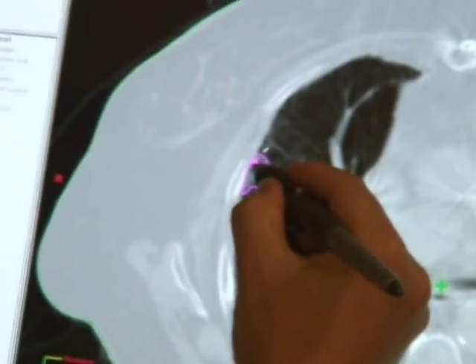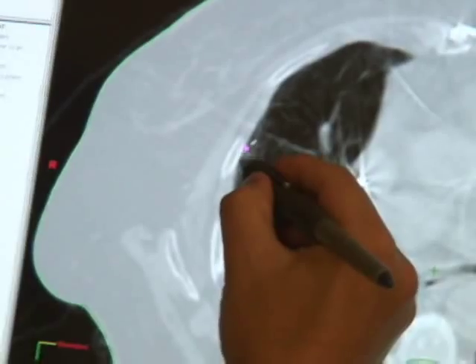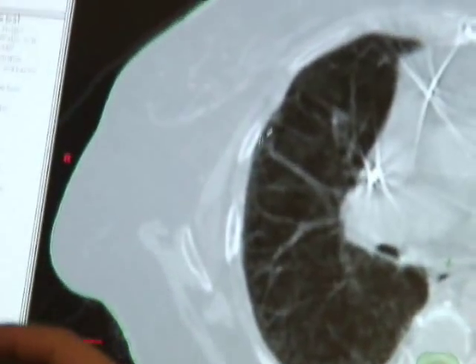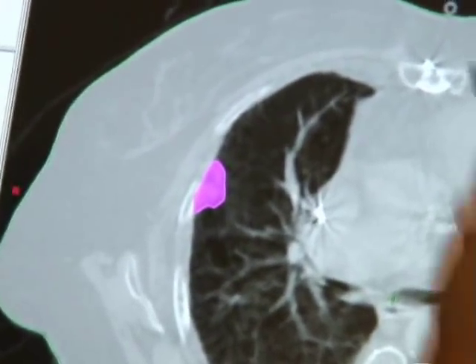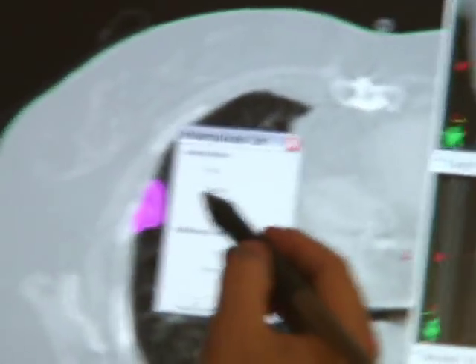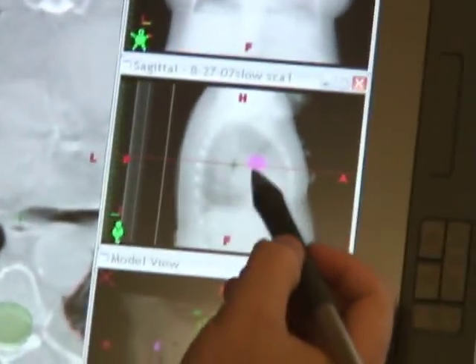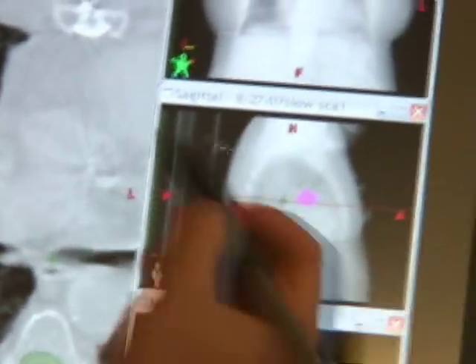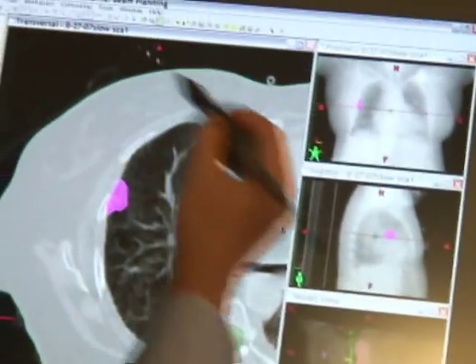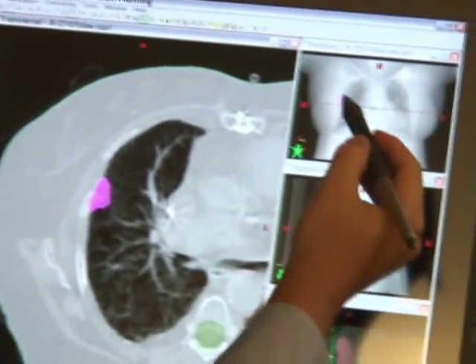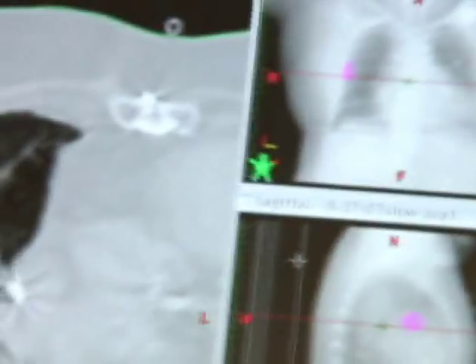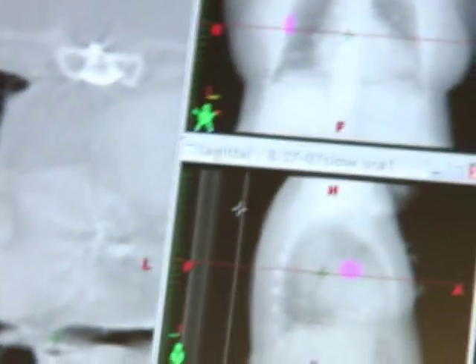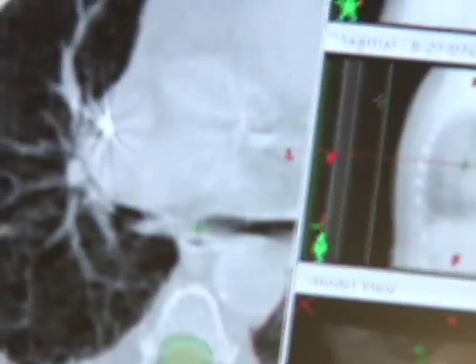This is a slow, very slow CT scan simulation. You can see here in this view how I've not contoured every slice, but when I go up here and do interpolation, we now fill all of that. This is sort of typical of the slow CT scans — you see an elongated appearance to the tumor, and that is overestimating the actual tumor size, but it gives you the correct ITV so that you can cover the tumor.